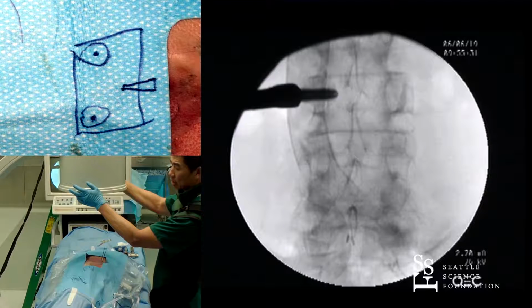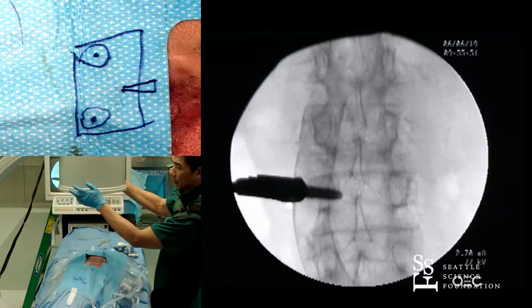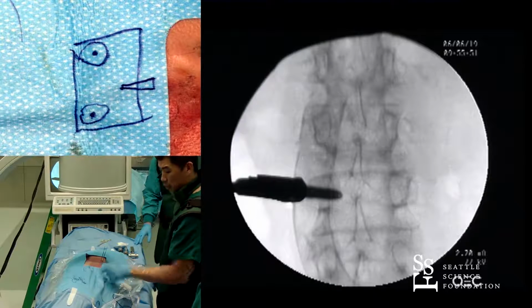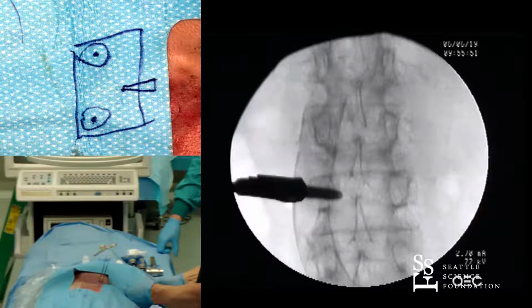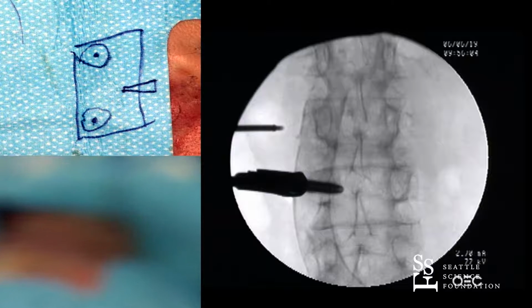Shot. Okay, wigwag. Shot. Okay, right there. It's the same thing. We're going to target this little circle, and you see the circle above. Shot. Beautiful. Knife.